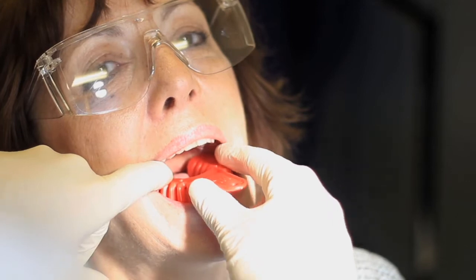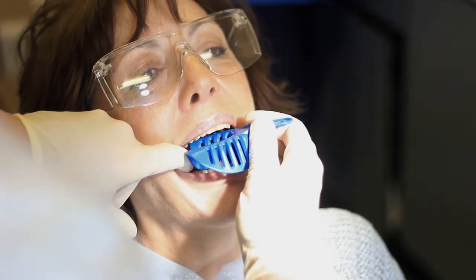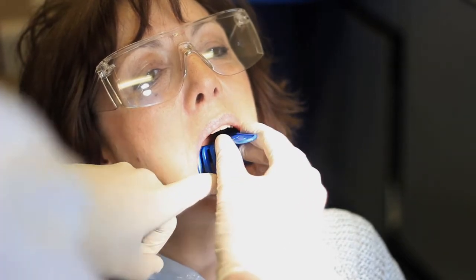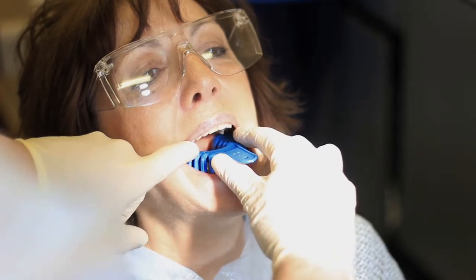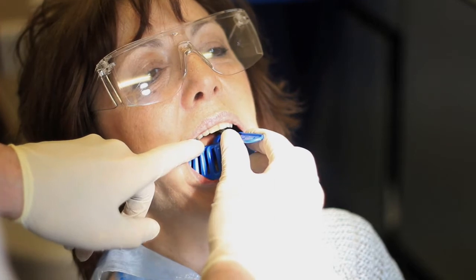That's good. What we shall do is we'll just try the large one in just to see if it fits or if it's too big indeed. So again, we'll just stretch your cheek out the way and see if we can fit this impression tray in. Now that to me looks as though it's too big for your mouth. Does that feel as though it's too big? It does. Okay, so I think we shall use the medium sized tray. And once again we should try the same for the top as well.